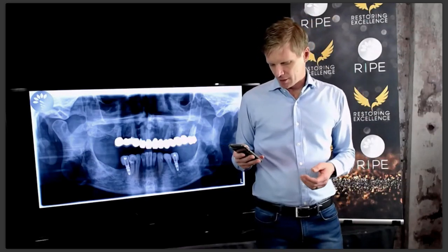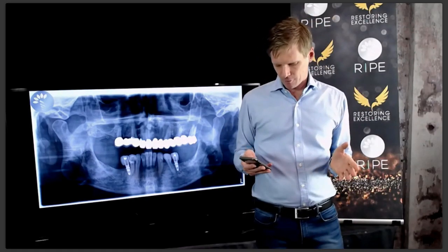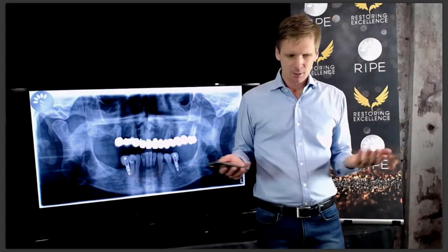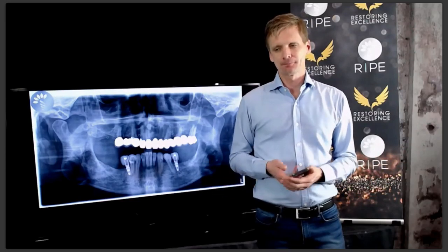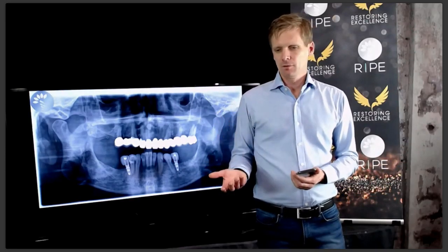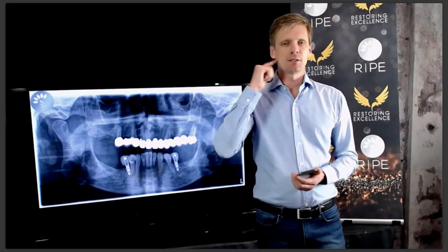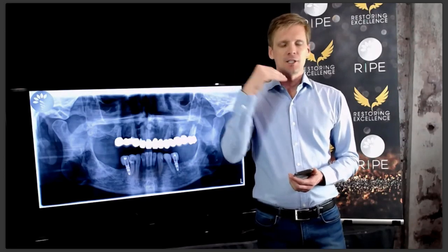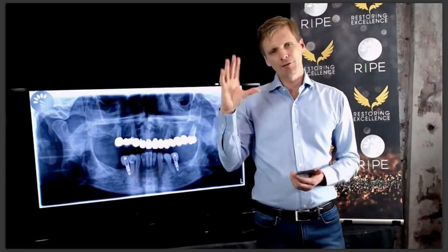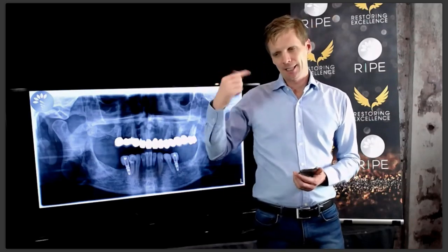How do you adjust the patient bite when the patients are in temps and also after the permanents go into the full mouth case? So when you put patient in temporaries, I generally adjust the bite with a leaf gauge, okay? I jack them up with a leaf gauge until they touch on one spot, usually on one back tooth, and I adjust that until it's not touching, and then I take one leaf out and I drop them down and I check where it's touching and I adjust that, and then I take one leaf out.